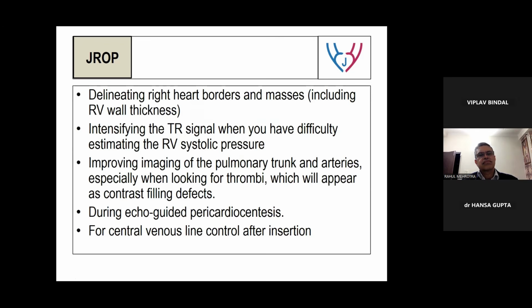Now, non-shunt indications are quite common. We have seen many people now doing what we did almost 20 years down the line. We have seen interventional cardiologists as well as the ICU in charge looking at the contrast in the arms for their central venous cannulation.